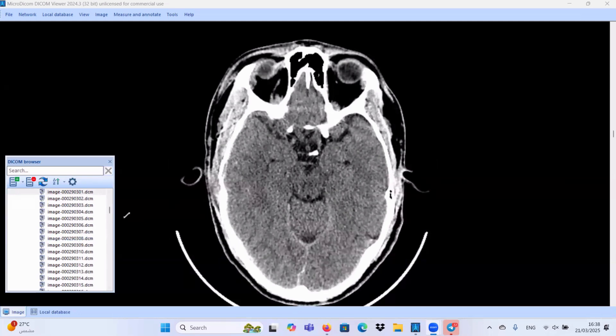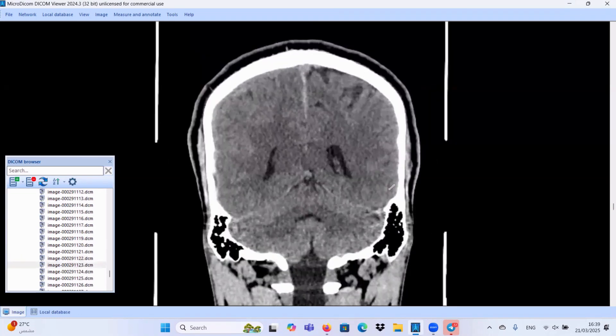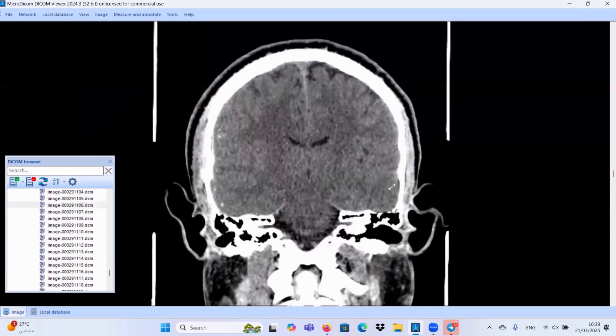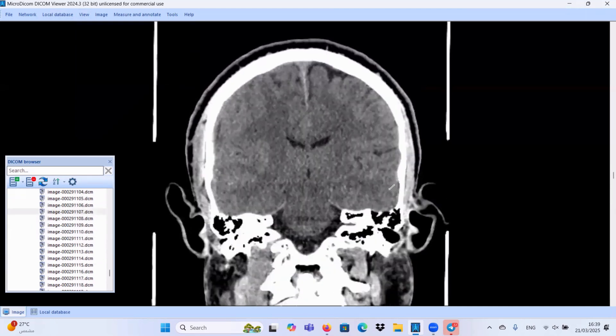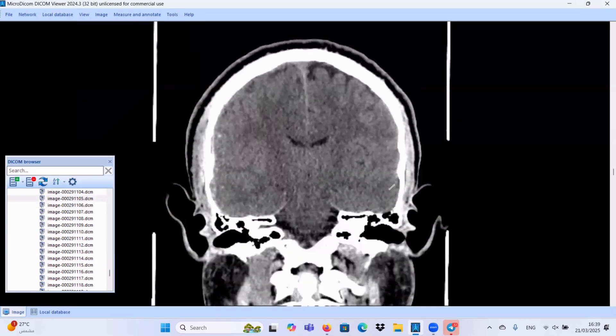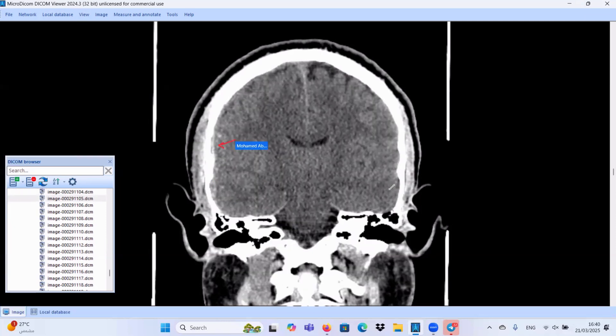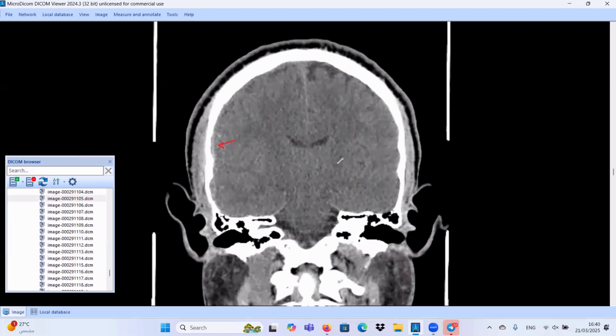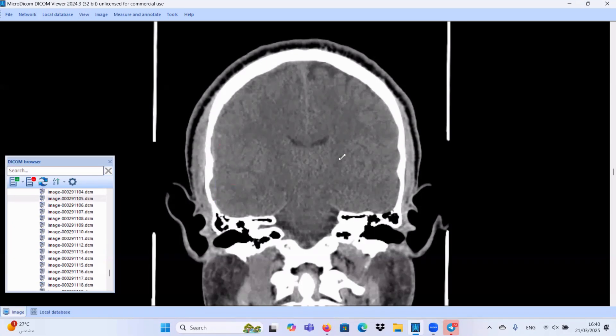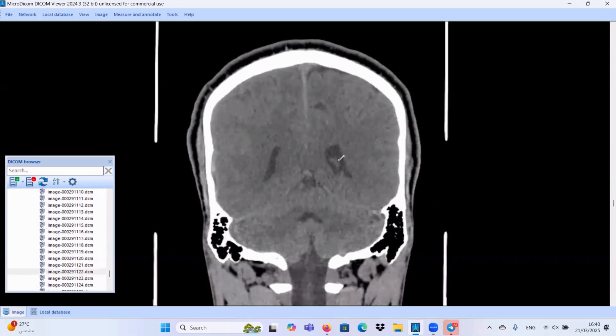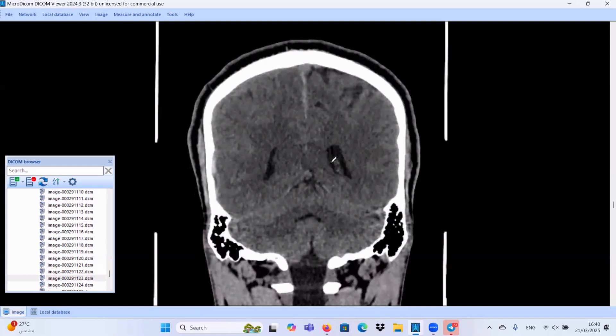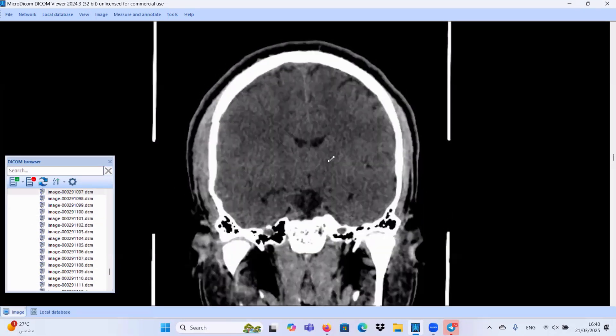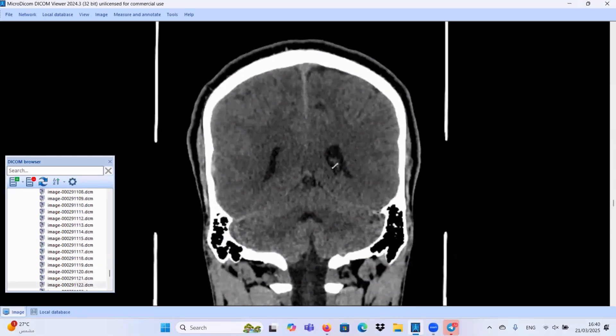Let's move to the coronal plane. In the coronal plane, you can check all the abnormalities again, but I think it is now clear that we have a small subdural hematoma. This is the border of the subdural hematoma. We should measure the maximum thickness of the subdural hematoma and this is one of our teaching points to pick up subtle abnormalities as you can see here. This is a small subdural hematoma along the right temporal region. Also, I think this is now clear we have a very thin film of subdural hematoma. We don't have any other significant abnormalities.